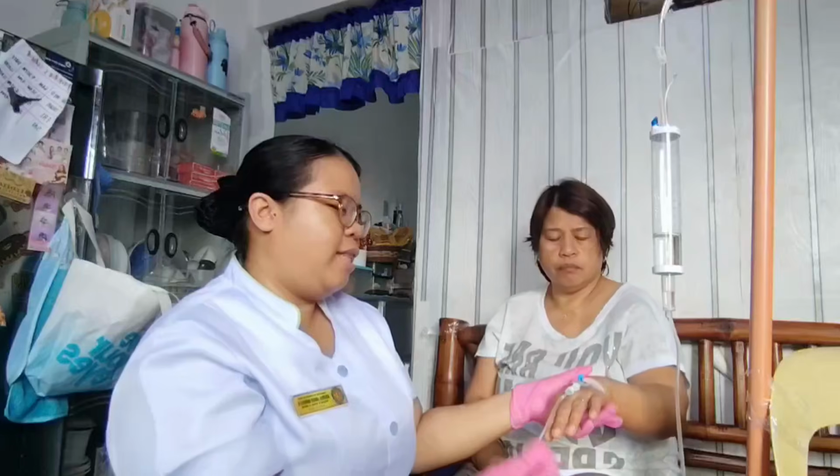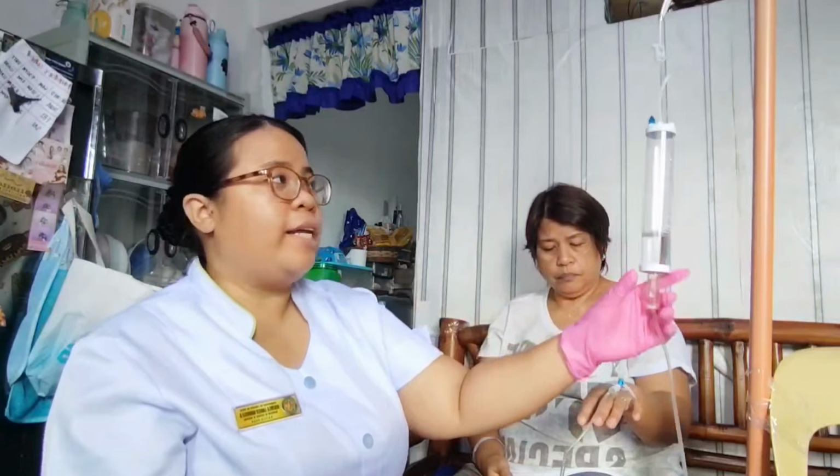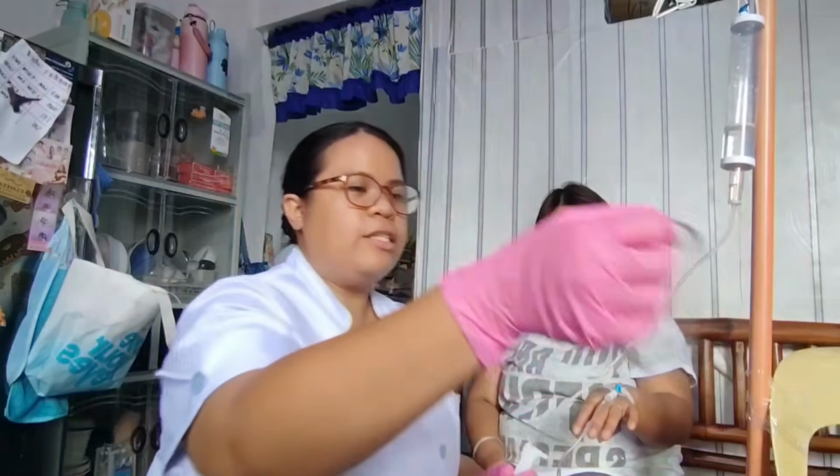We will now proceed in regulating the infusion rate according to the prescribed infusion duration and the rate. So now let's regulate this. So we will regulate this to 100 ml per hour.